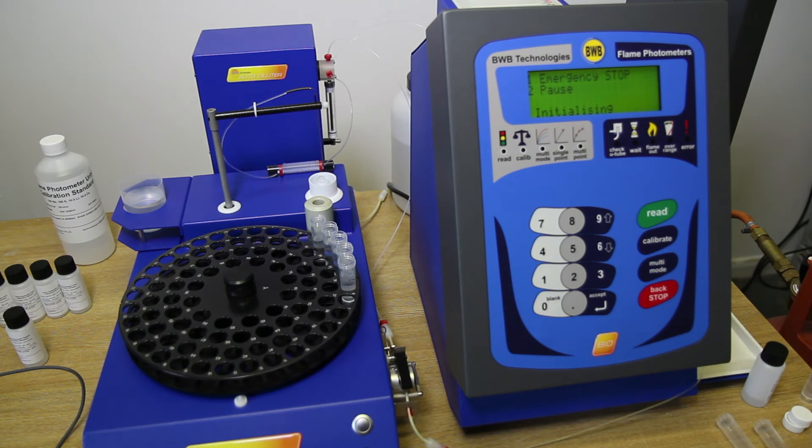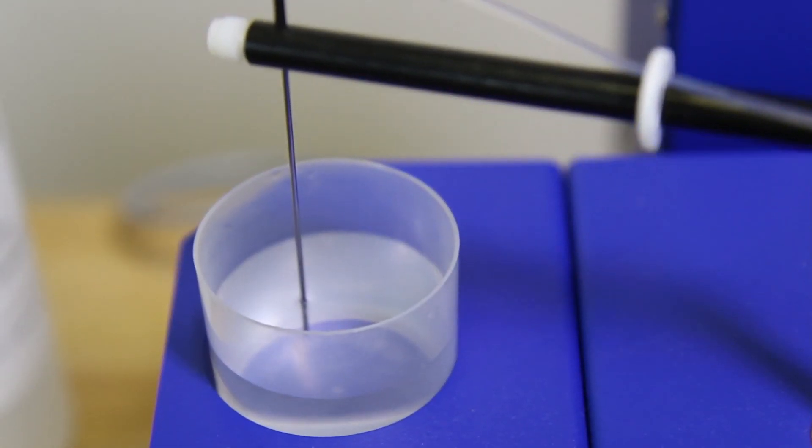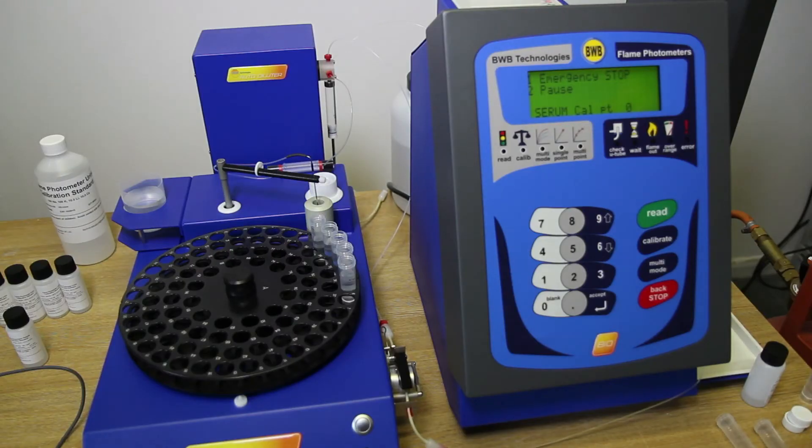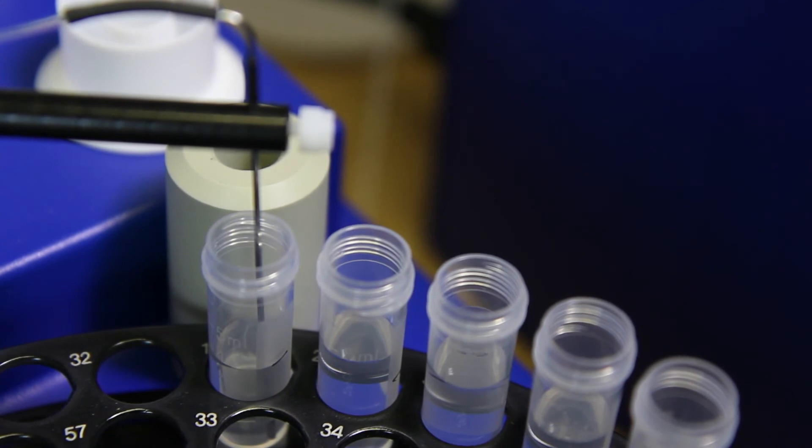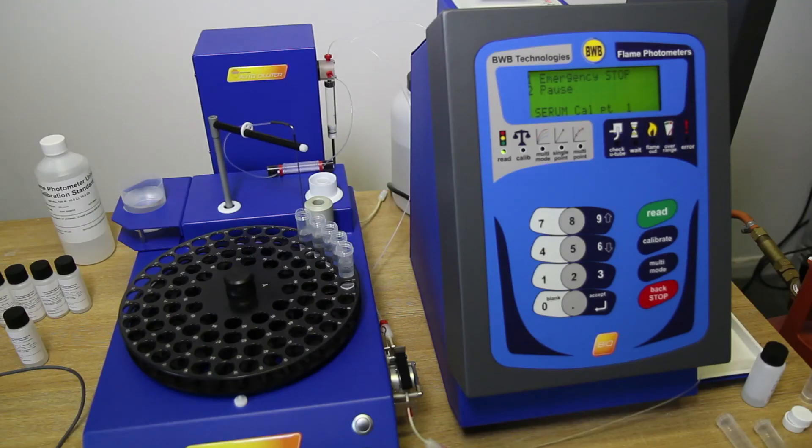The AFHS initializes and positions the carousel for reference solution 1. The BWB Bio will then flush the zero sample using fluid from the reservoir. Calibration of point 1 will then begin automatically using the solution in position 1 of the carousel.